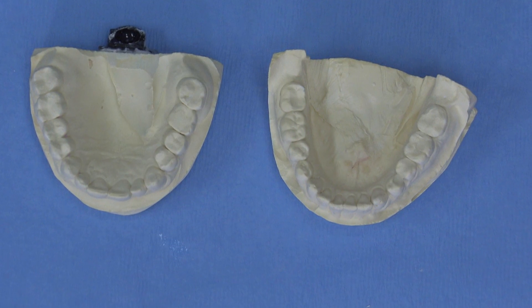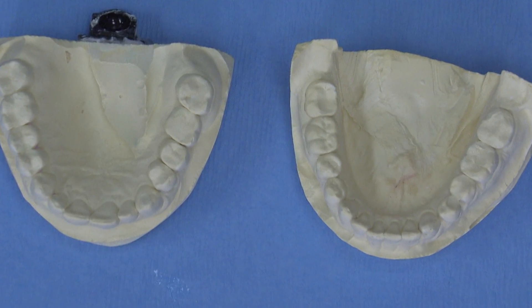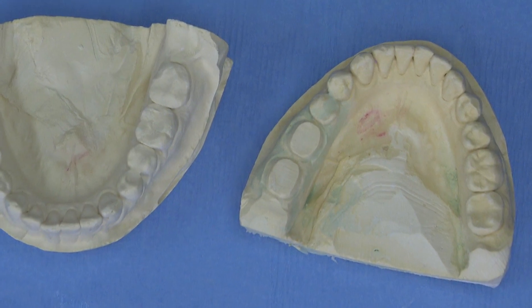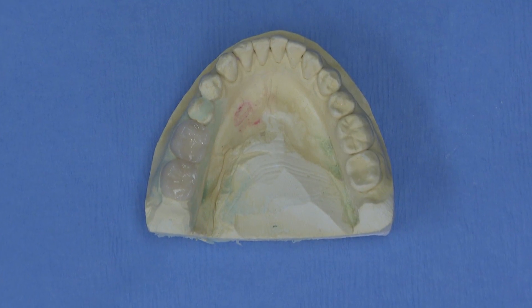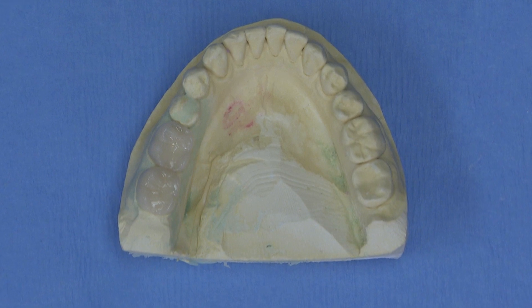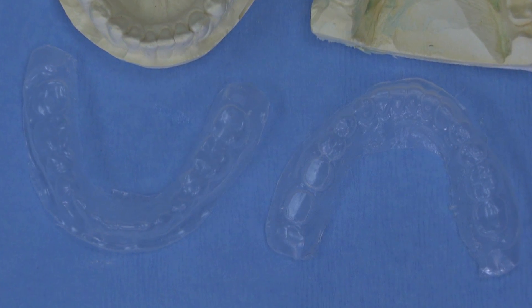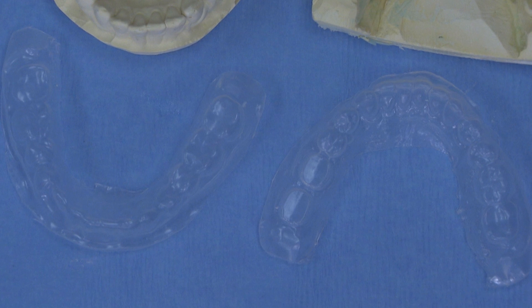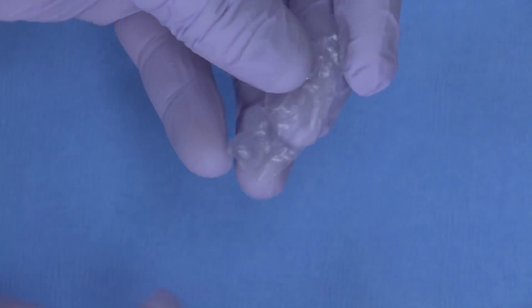Today I'd like to talk specifically about posterior BioTemps. The models we're going to use are all set up — the lab has done a rough preparation of these models so I have a basis of how these BioTemps are going to fit before I reline. I always try my BioTemps on the model first to make sure there aren't any interproximal reductions needed and they've been fabricated properly. The laboratory also provides plastic stents so I can try these in the mouth or on the models to make sure the BioTemps are going to fit my preparations before the reline.